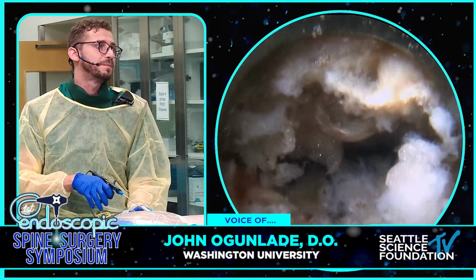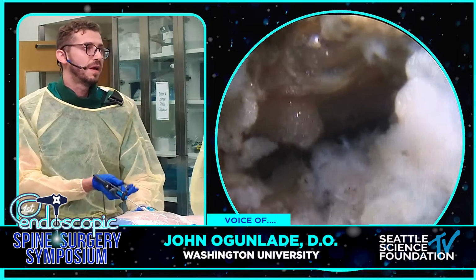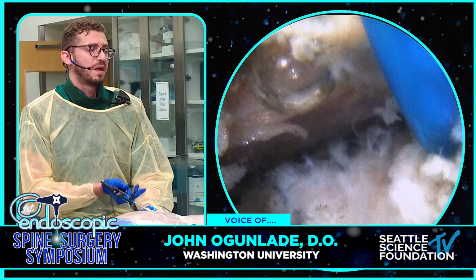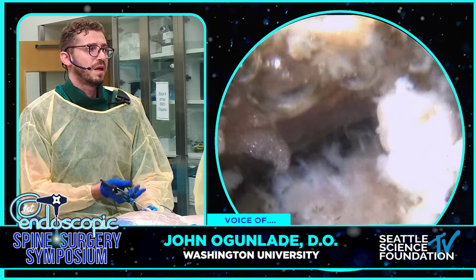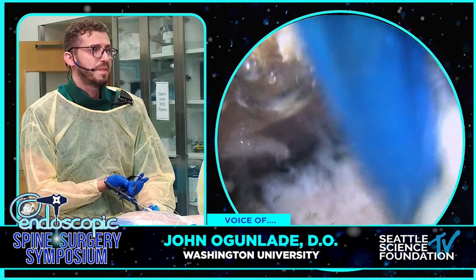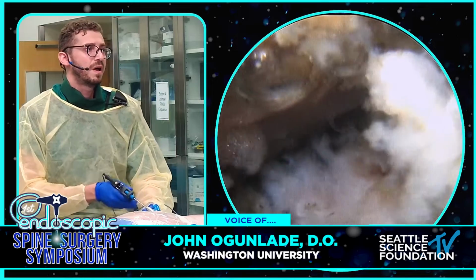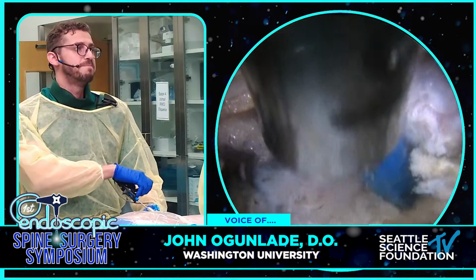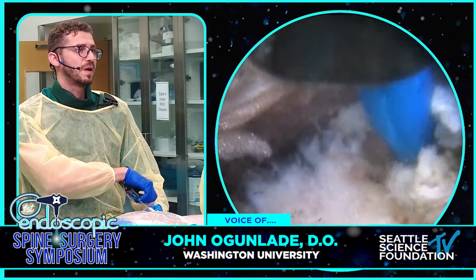I have a question for you, Osama. John here. Let's say a patient had an MRI showing a massive disc extrusion, and you signed them up for surgery, bring them into the OR, and get to the disc space with the same approach, but you don't find the convincing disc herniation that you expected to see on MRI. What would you go through at that point?